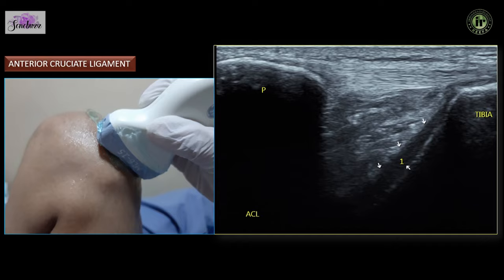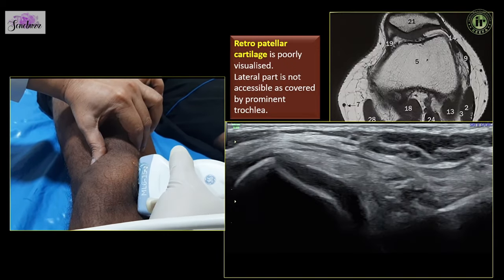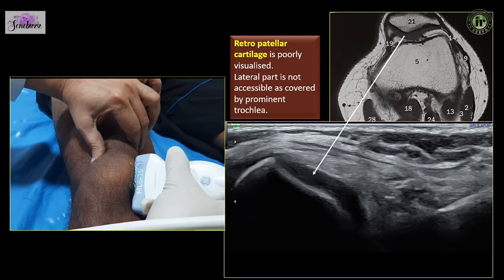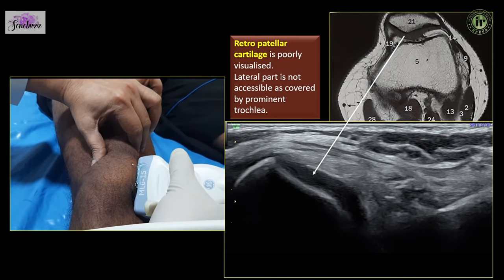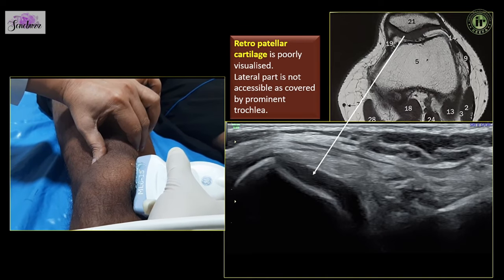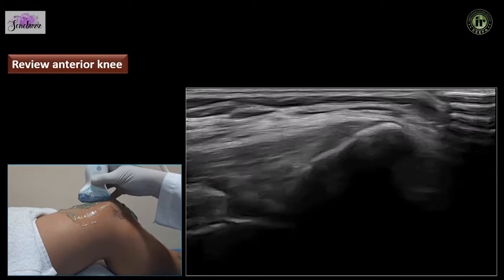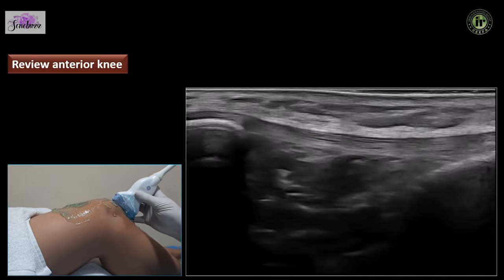Keeping the probe over the tibial tuberosity and rotating the cranial end towards the lateral femoral condyle, you can visualize only the superficial part of the anterior cruciate ligament. With the knee extended, we can push the patella from its superior aspect inferomedially and scan to see part of the retropatellar cartilage on the medial side. Remember the lateral part is not accessible as it is covered by the prominent trochlea. This gives us a good overview of the extensor system of the knee sweeping along its anterior aspect.